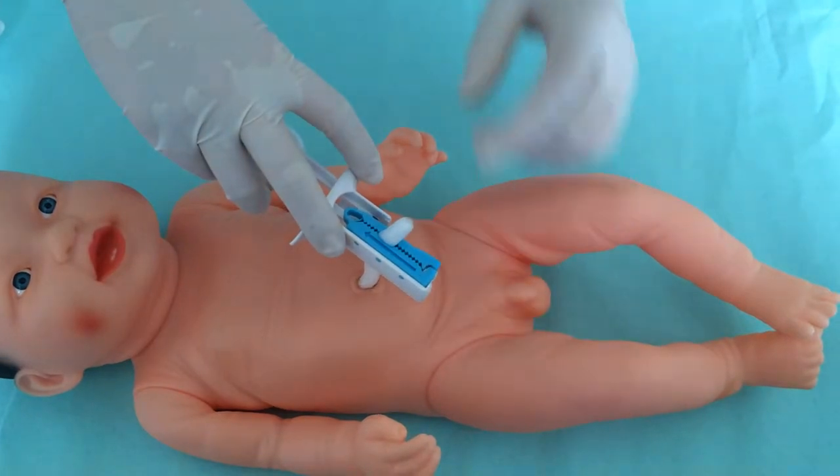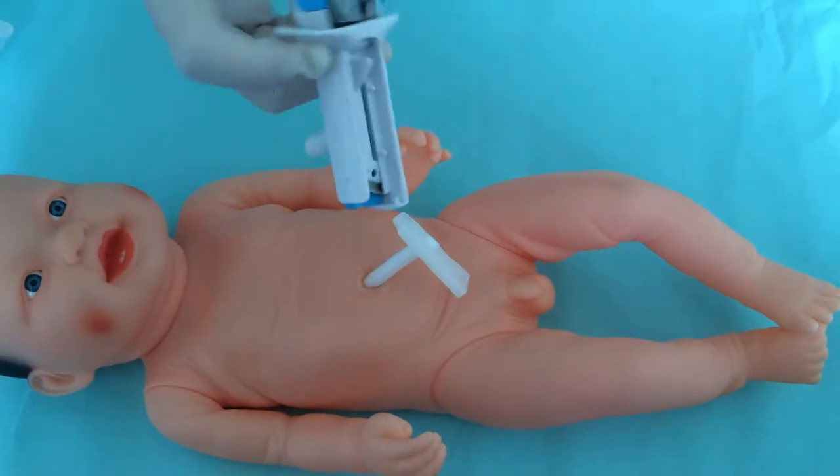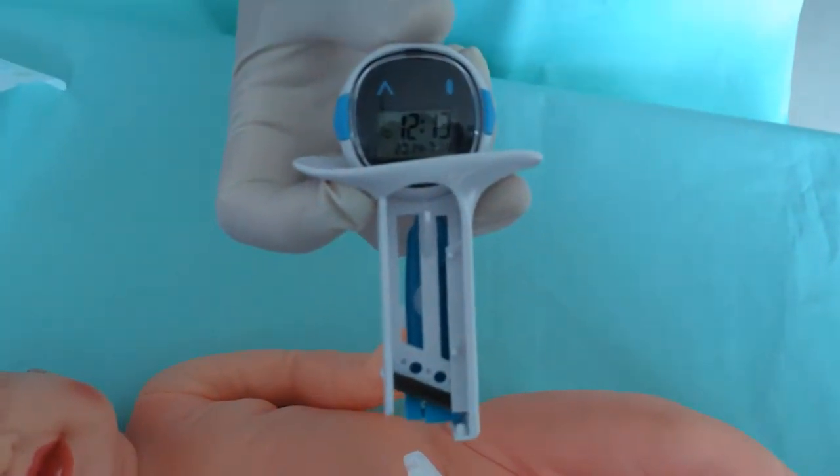Use scissors to cut the umbilical cord. At the same time, it will automatically record the baby's birth time.